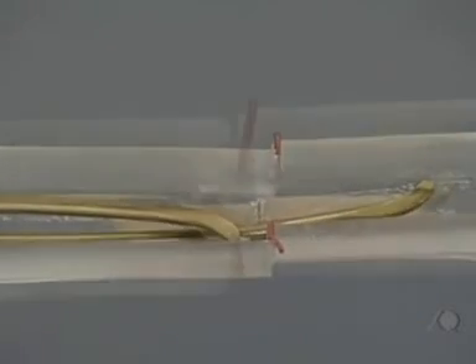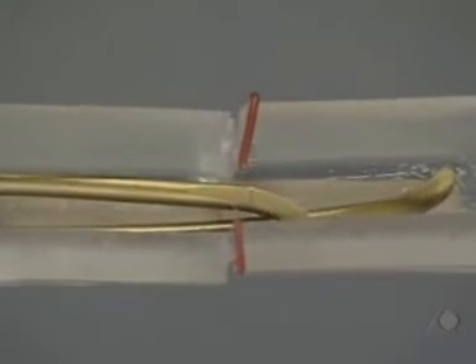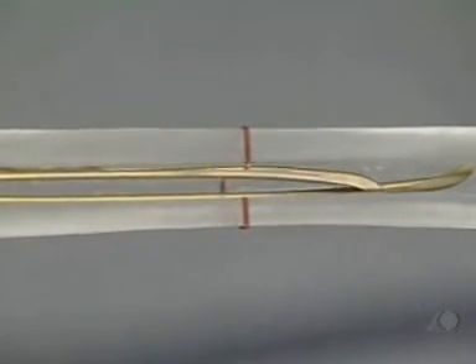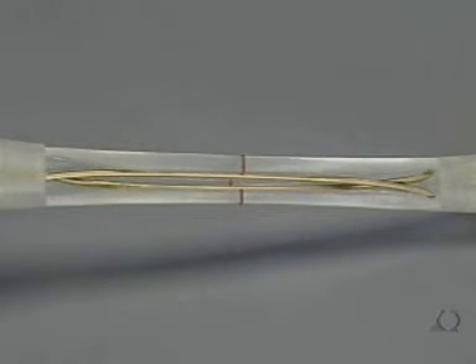The nails are then advanced alternately to just short of the metaphysis. Care should be taken to ensure that in the proximal fragment, the tips of the nails are correctly aligned in the frontal plane; in case of uncertainty, this must be checked with the image intensifier. At this stage, rotation is also checked and, if necessary, adjusted — adjustment will no longer be possible after fixation in the metaphysis.